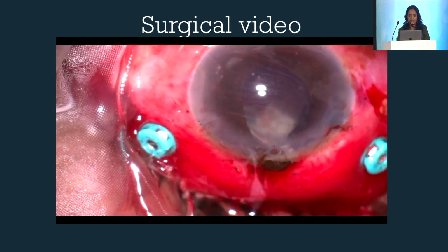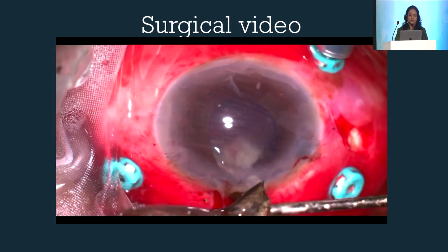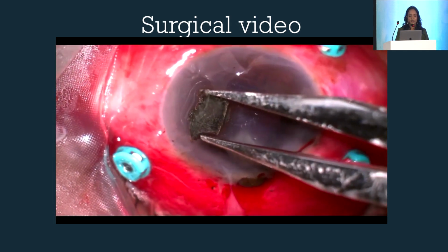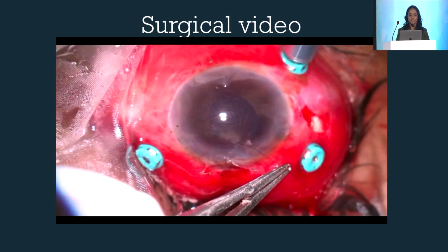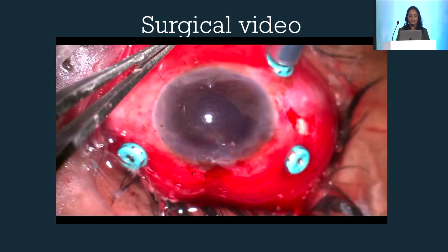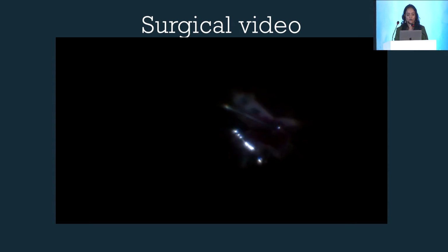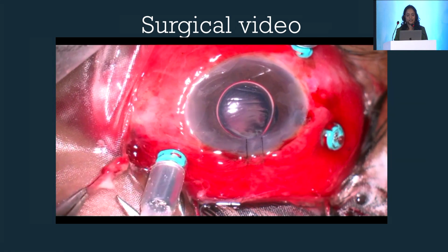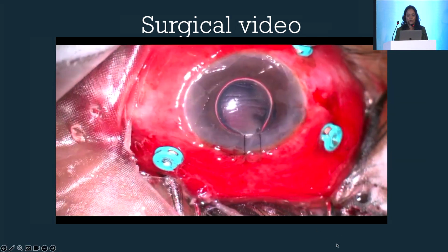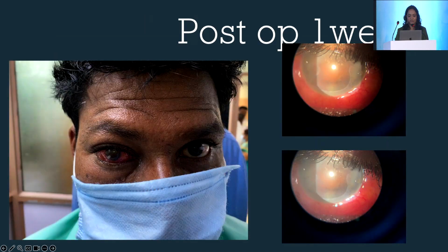So this was a very challenging case with incarcerated retina which was extruded, and we had to cut it flush with the sclera first, then go inside, remove all the exudates, and then find that the retina was having a 360-degree giant retinal tear with necrotic retina. And I couldn't save this eye. I just did an FAE and came out, hoping that at least this patient didn't undergo an evisceration. So the eye was saved.